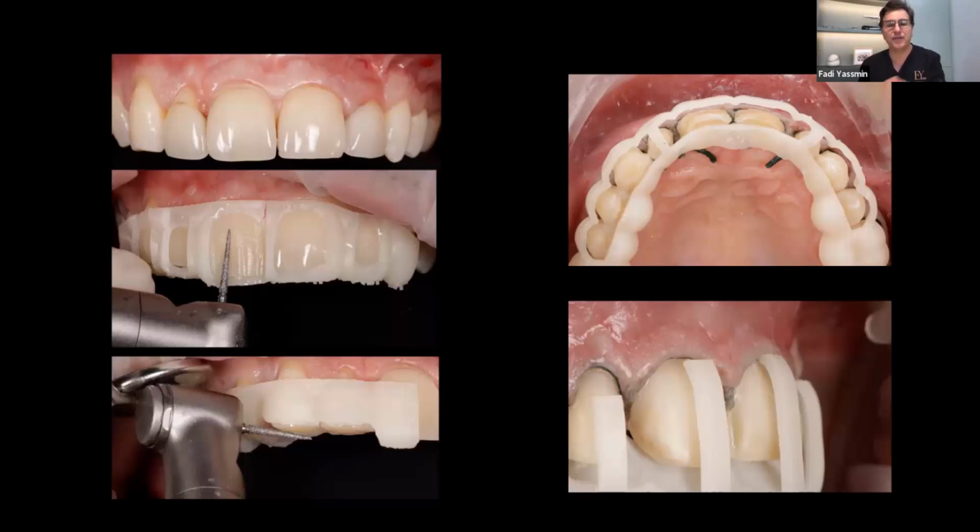I think we had this conversation offline. For me, I'm not very technical with this stuff. I'm clinically based. I know what I need. I wouldn't have an idea how to design these, but I work with CAD specialists, planning centers, digital designers. I know what I want and they design it for me and I use it. So there's a lot of services out there. Don't think I get in there and design all of these. I know what's available, so I'm just happy I've got my printer. I can print them, prep, and follow my protocols.